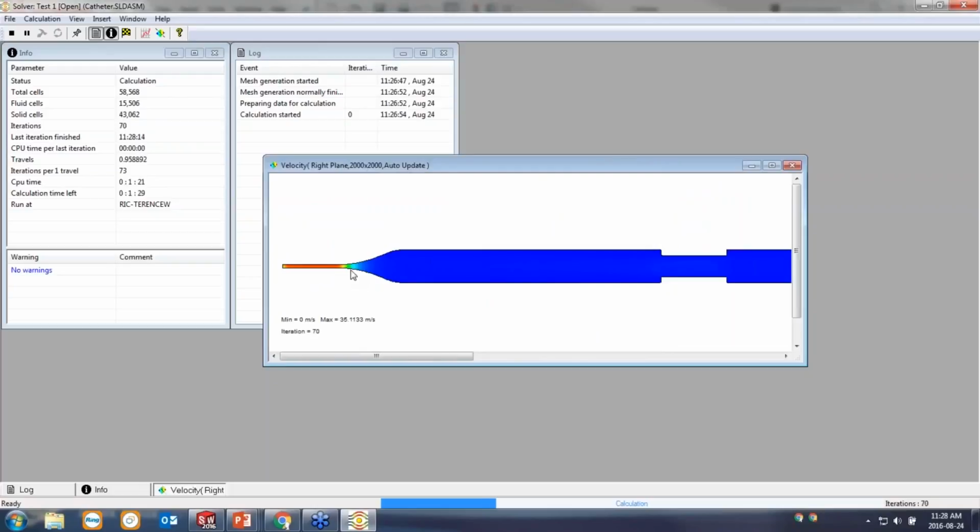And this is great because if you see something that you're not expecting, you know right away. You don't have to wait for the entire solution. This is a pretty simple analysis at this point, but as it grows in complexity, it takes longer and longer to solve a problem. And you definitely don't want to wait half an hour to find out that maybe you switched around your boundary conditions, applied them to the wrong faces. So it's great to get this feedback right away. If it's wrong, you can stop the analysis and go and fix that before waiting that half an hour.